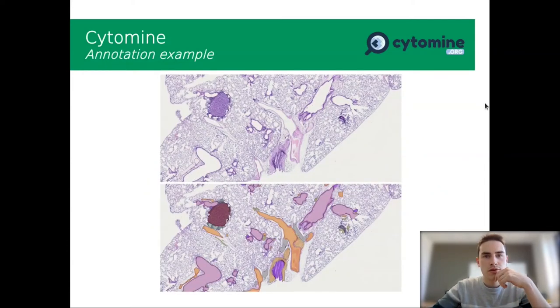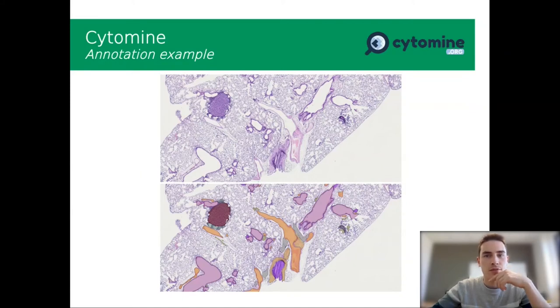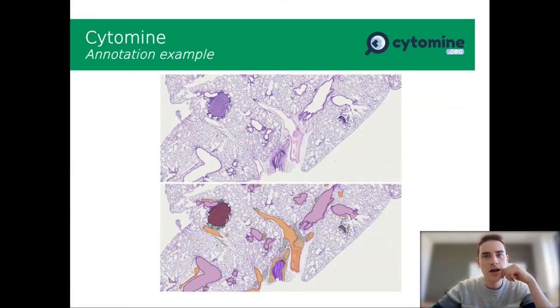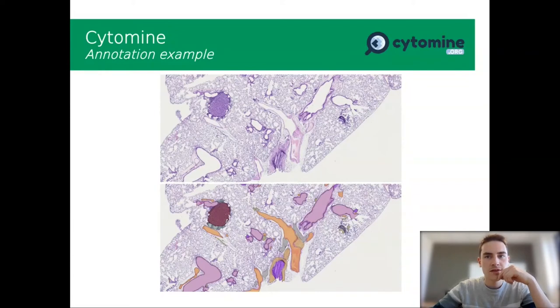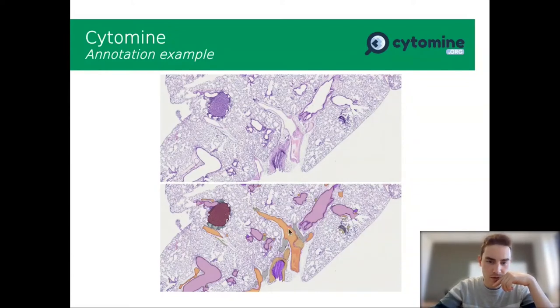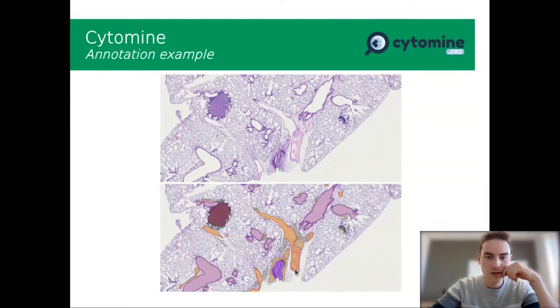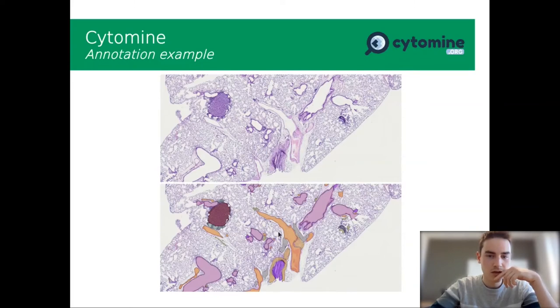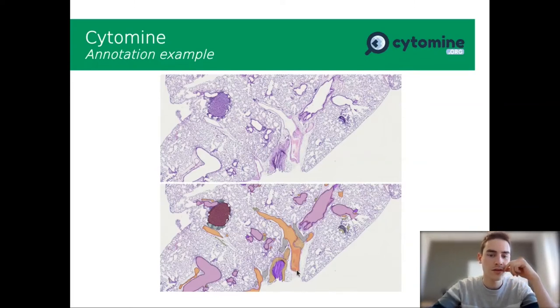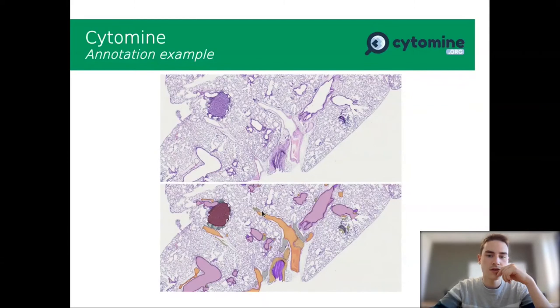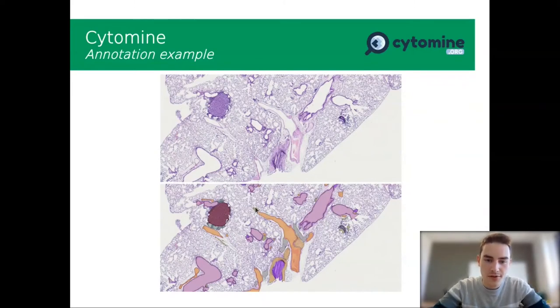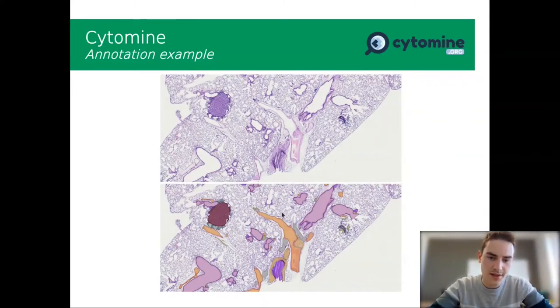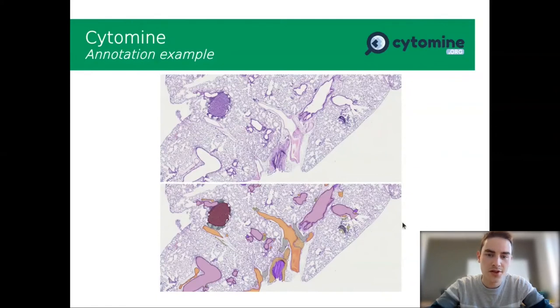Now we have an example of high resolution image with its annotation at the bottom. So each color corresponds to a label. And we have the layer of the labels, the mask, and you also have the original image.